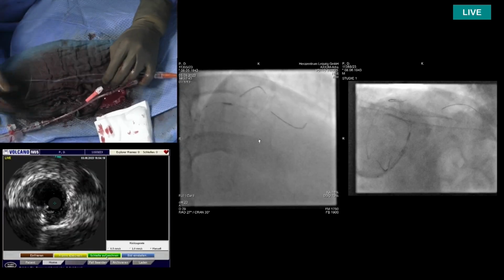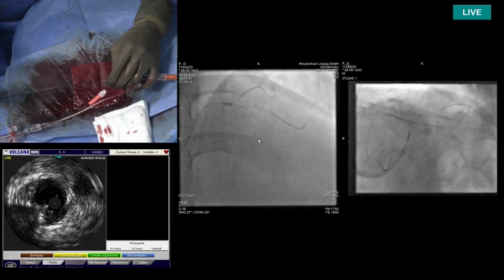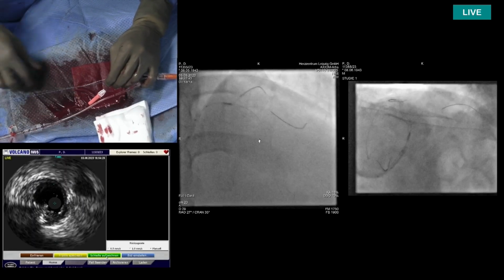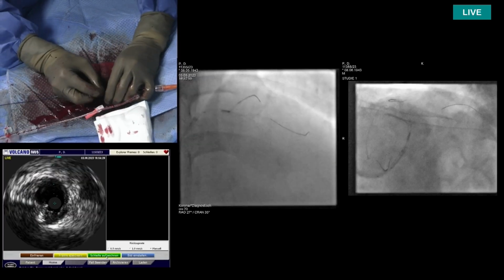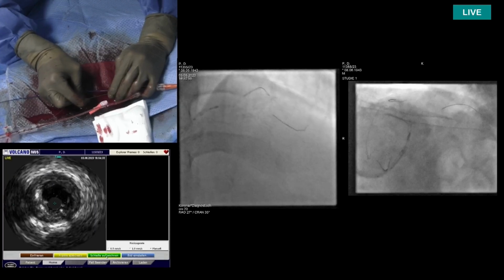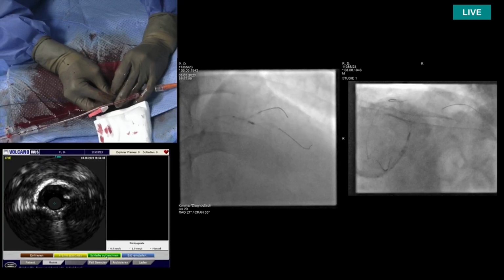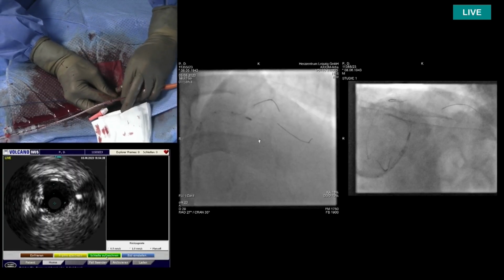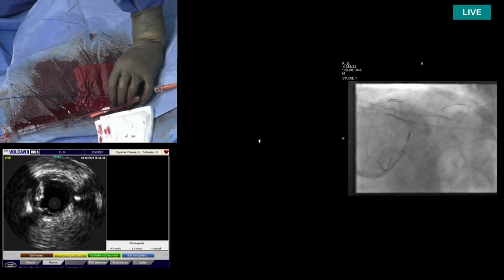The design of the trial is that the physician decides whether he will use rota up front and then randomize to cutting versus shock. So you will have one arm that is cutting versus shock without rota and another arm that is going to be rota shock versus rota cut. This is 400 patients and it's powered for minimal stent area as the endpoint. So it's going to be an interesting trial.